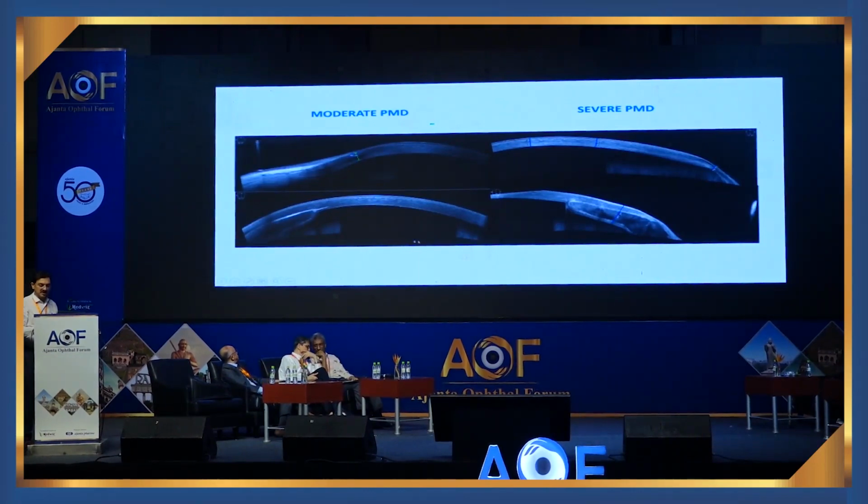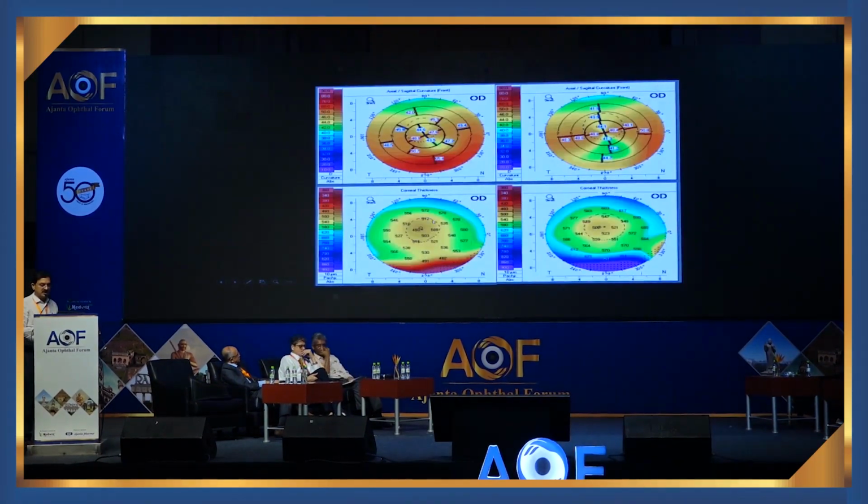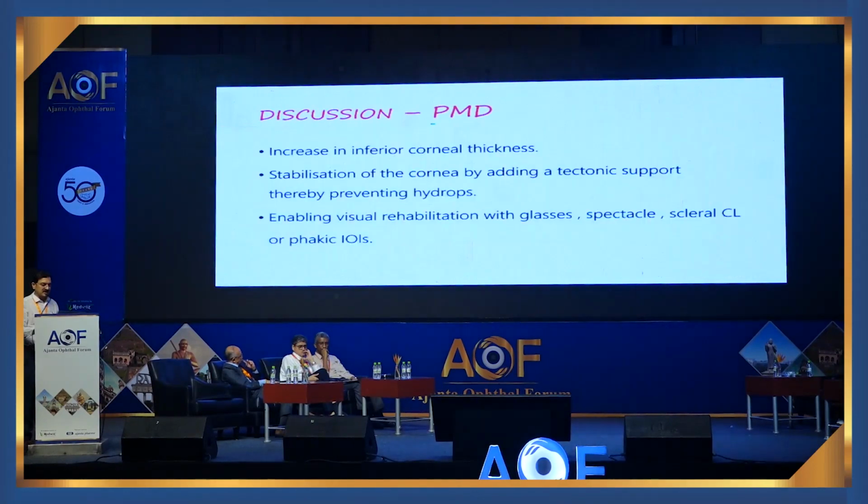They are very stable. The cornea becomes very stable, and this is the post-operative. It improves, but astigmatism doesn't change much, but it becomes a little bit regular. This is the pre-op, this is the post-op appearance, and these are over a period of a few years. And this is our standard technique now. Routinely we do it for all our cases of PMD. And the advantage here is it stabilizes very well.